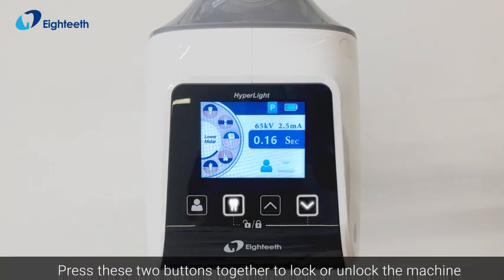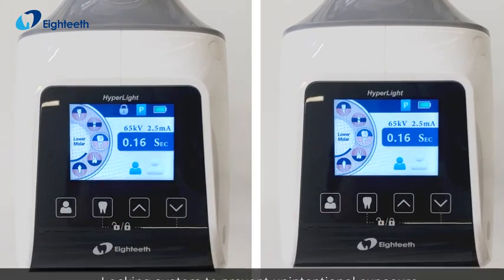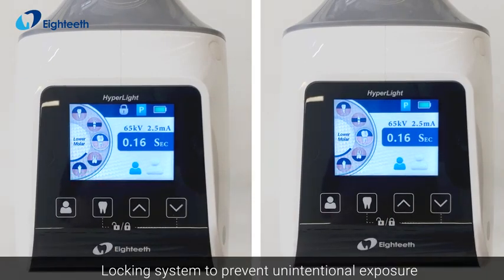Press these two buttons together to lock or unlock the machine. The locking system prevents unintentional exposure.